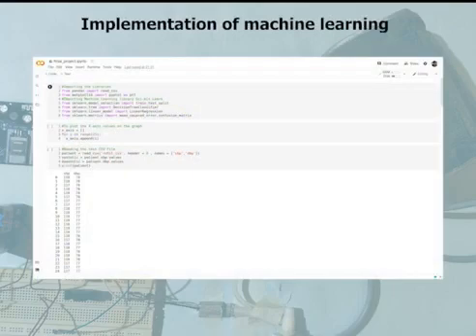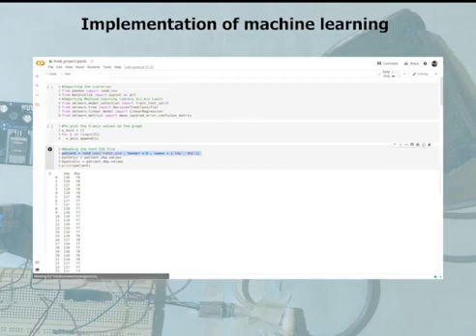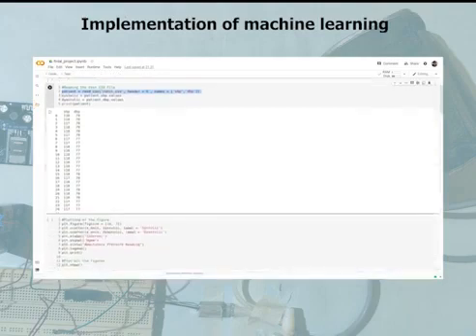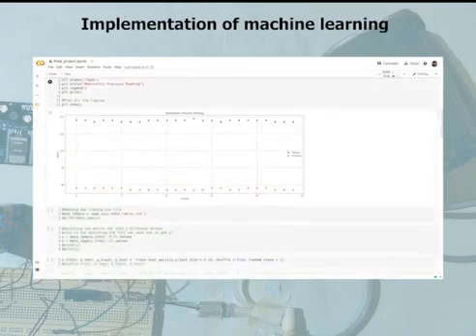Moving on to the machine learning part, we have used machine learning in our project for prediction purposes. Now as we see on the screen, the necessary files are loaded. One is the Rohit and the other two files are the data sets. Now the patient's data is loaded into the program. Here we can see the numerical representation of Rohit.csv. As we move forward to the next cell, we can see a graphical representation of Rohit.csv.